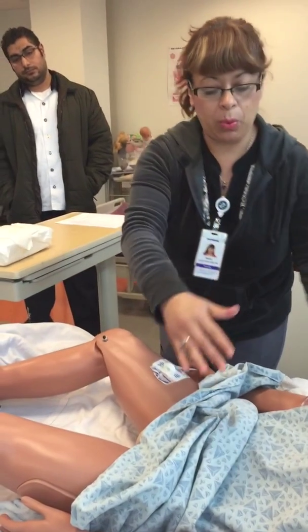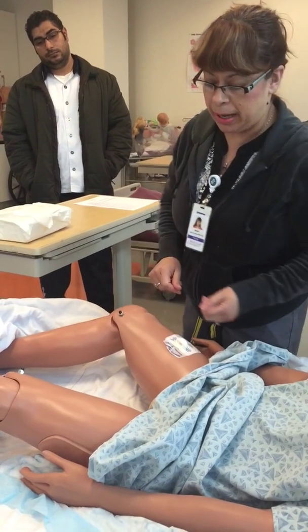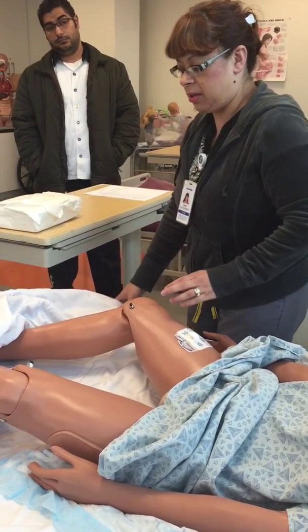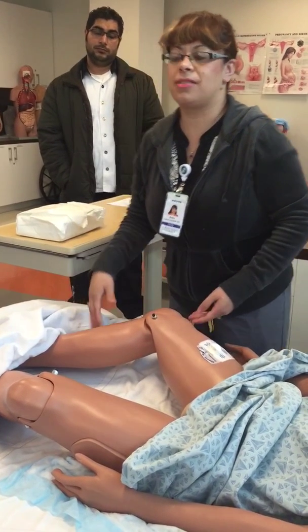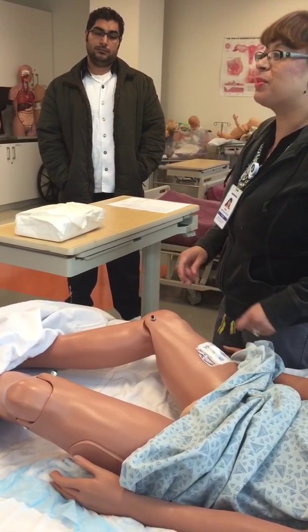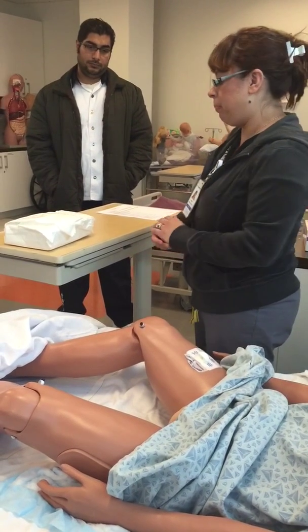And if she's too cold, you might want to put a bath blanket over her, but I don't have one here. There are even ways of positioning them where you can actually roll blankets on their legs, so we're not going to get that intense. We're only going to expose here, and if she was cold, we'd put the bath blanket on.